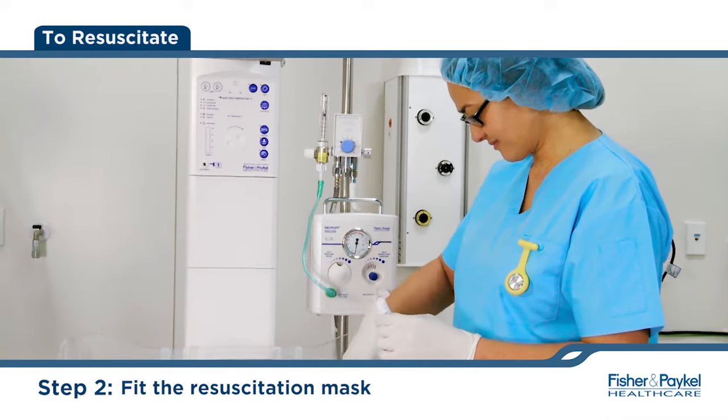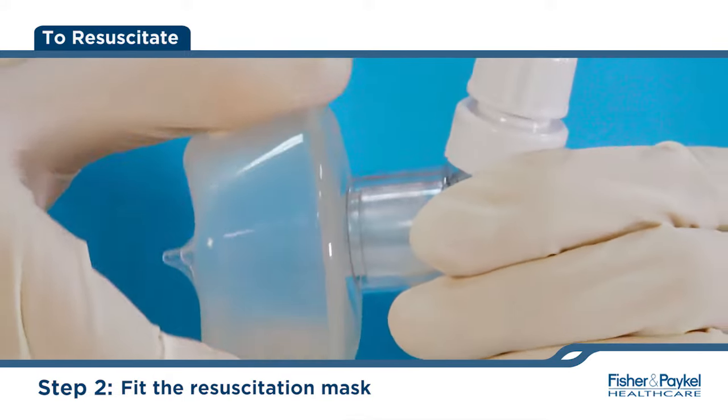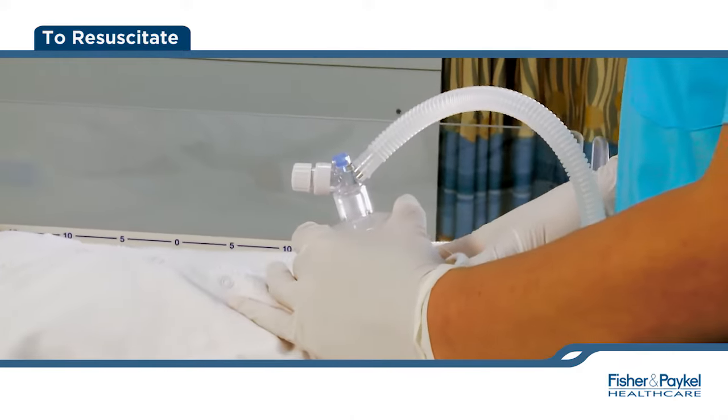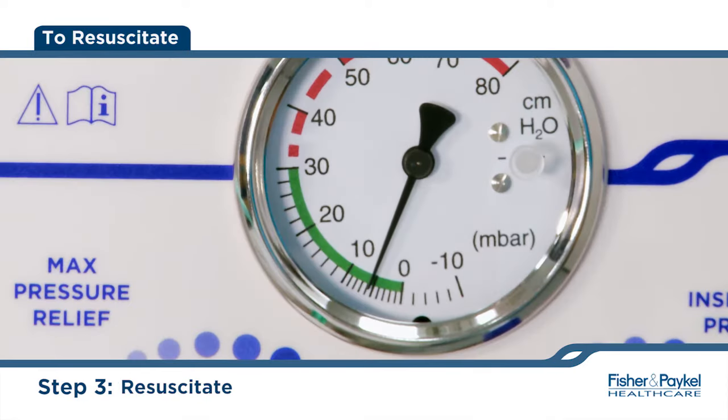Fit the TP circuit to the infant resuscitation mask and place the mask over the baby's mouth and nose. Resuscitate by placing and removing your finger over the PEEP cap to allow inspiration and expiration.